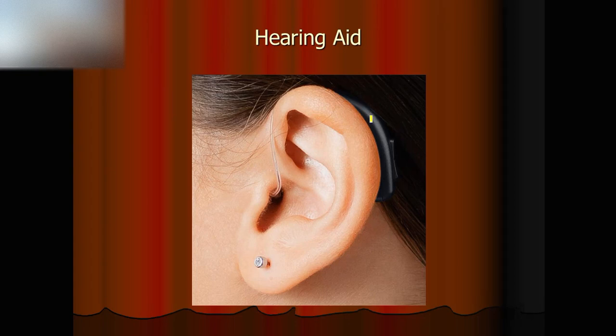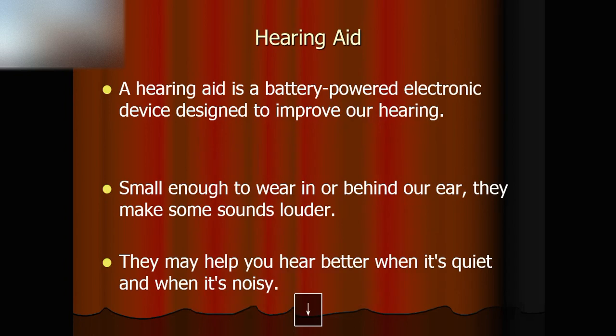One is facing forward, one is omnidirectional, so that the 2 microphones can enhance each other for the capability of detection. And it may just look like tiny holes drilled on the hearing aid. So it's not like a big microphone. No, it's a very mini structure on the hearing aid.